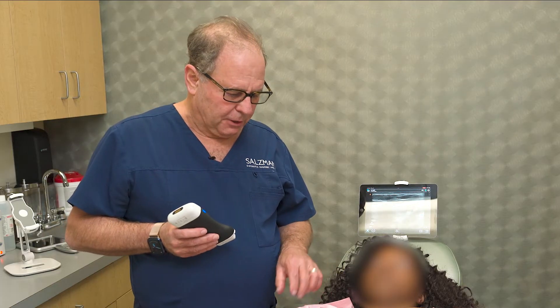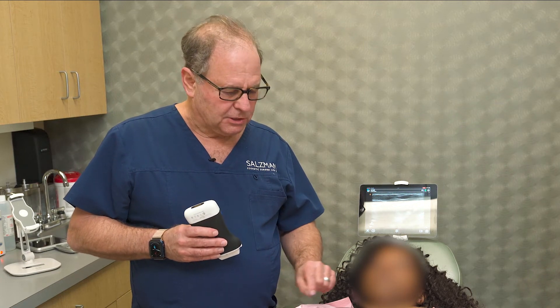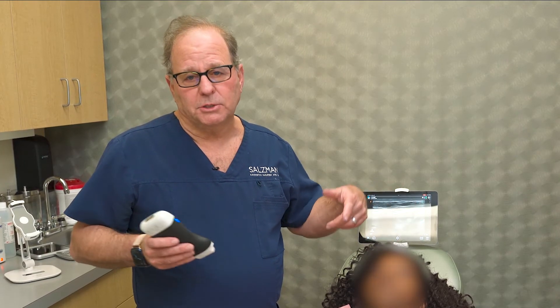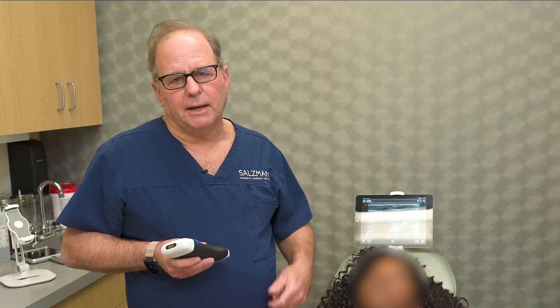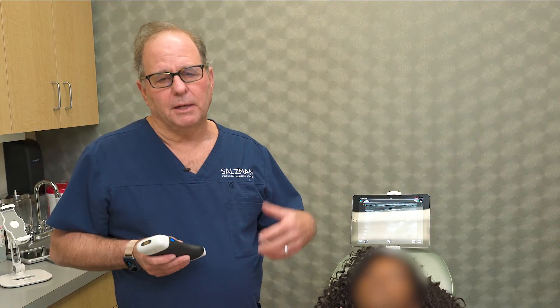So what I found is that the right implant appears to be broken at the top at 12 o'clock because we see a discontinuity of the elastomeric shell and what we think is free gel, which has a snowstorm appearance on the outside. The left one seems to be intact but is upside down, which we see not infrequently. The more high-profile the implants are and the stiffer and more cohesive the gel is, the more likely they are to go into the upside-down position and not flip back. This lady has grade one capsules on both sides and looks symmetric. As you get to high profile and extra high profile, when they flip you can really see it — it's obvious because the breast doesn't have the projection it had when the implant is in the proper position.